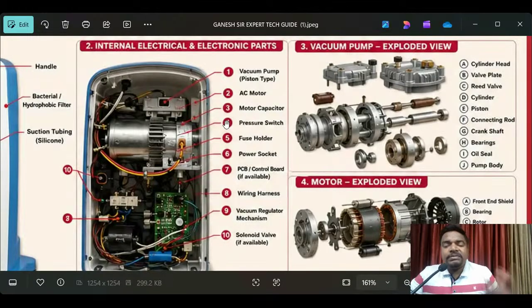Understand? But sometimes the motor will be changed, and board components are different, because there are so many types of electronic components available in the society and the market also. So that's why you should be perfect before you touch the equipment. Electrical and electronic are subjects available in your qualifications. That's why education is basic and important, and you should be careful.